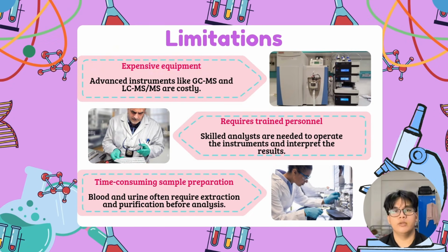Now, we move on to the limitations of chromatography in forensic science. First of all, chromatography requires expensive equipment, in which advanced instruments like GC-MS and LC-MS are costly. It also requires trained personnel, in which skilled analysts are needed to operate the instruments and interpret the results.